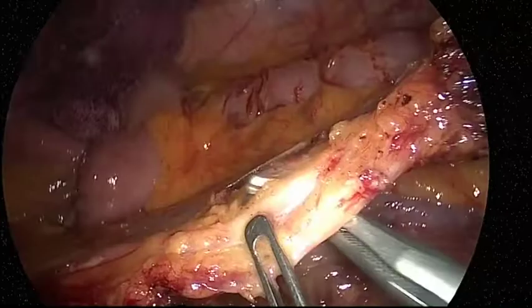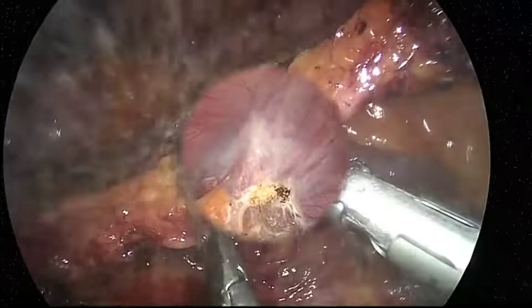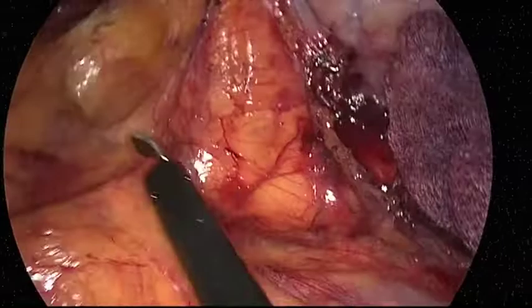The inferior mesenteric vein and left colic artery are clipped and cut. The lateral attachment is separated, dissecting the Toldt's fusion fascia and continuing to the median dissection plane.